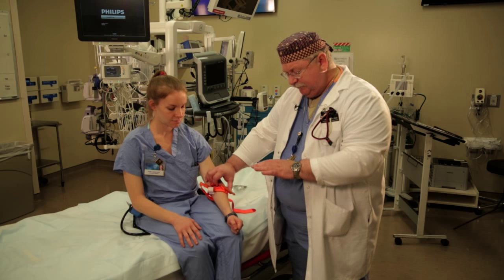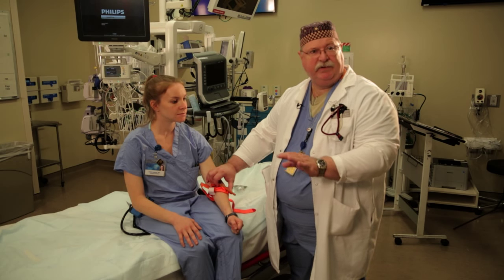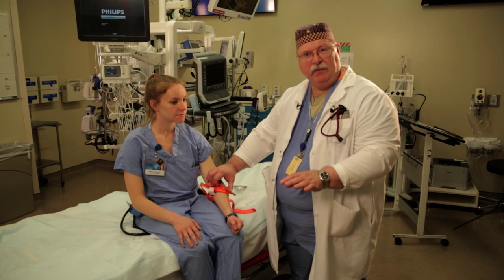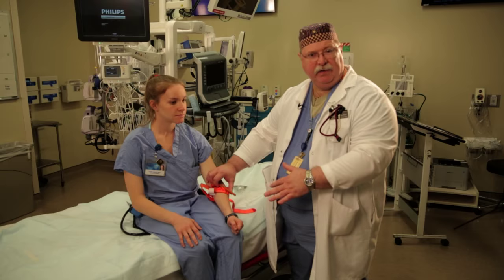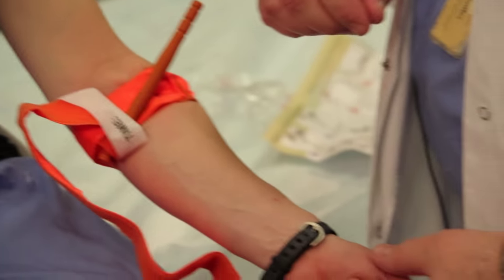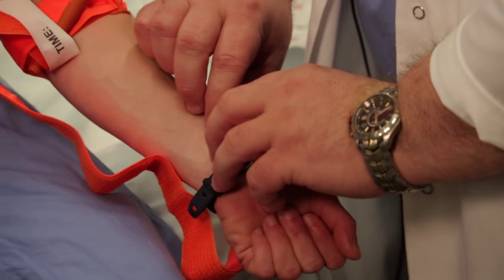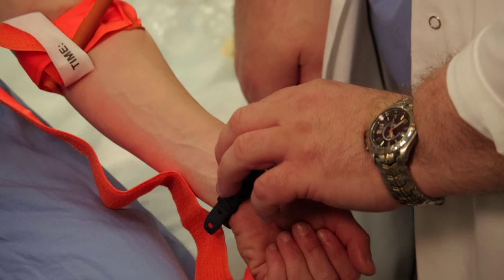We're not going to leave this on for hours and hours. We're going to rush this patient to definitive care at a trauma center and we'll get control over that bleeding, get rid of the tourniquet, and then restore perfusion to the hand. But right now, there's no blood flow getting in down here because we have this tightened up. The rule that we use for taking the tourniquet down is at the definitive care site — don't take it down beforehand.